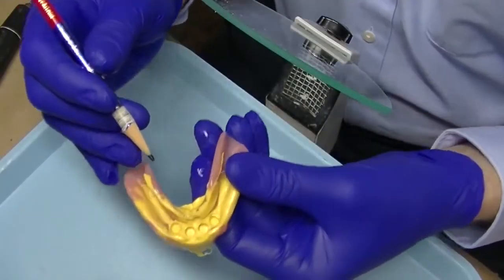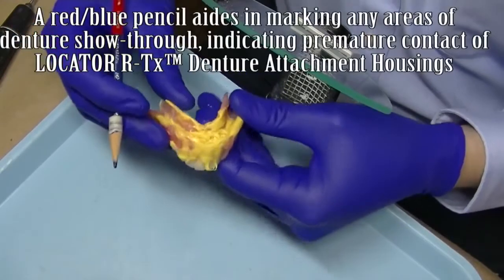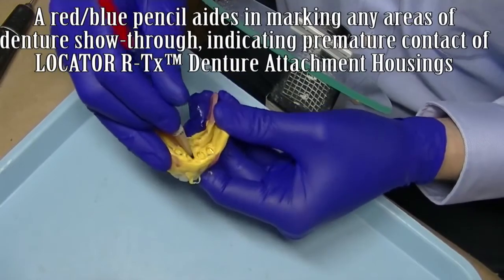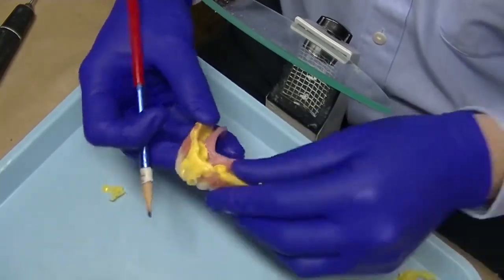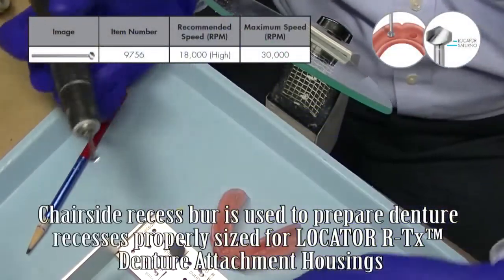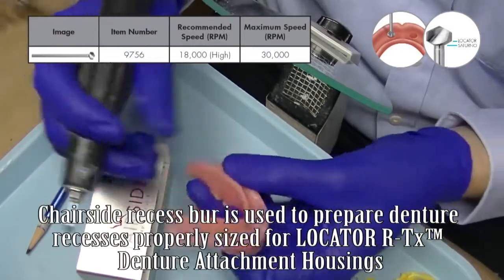The yellow color of the chair side light body PVS contrasts perfectly with the pink color of a standard complete denture. Using the blue end of a red-blue pencil, you can mark any areas where you see pink showing through the yellow portion of the impression material.